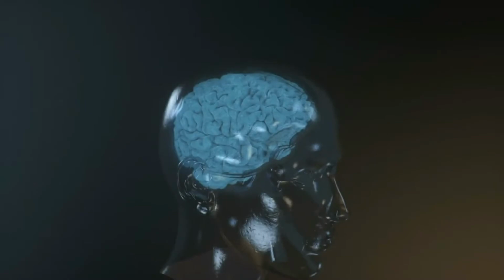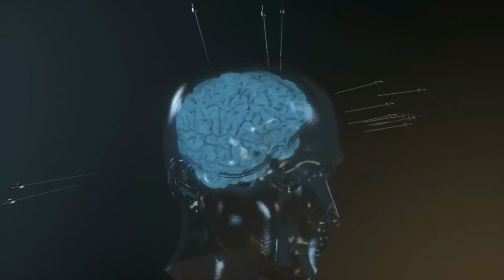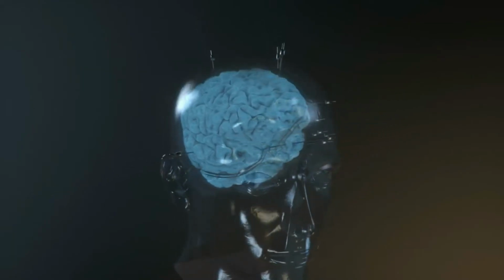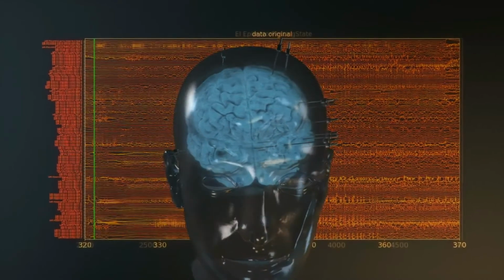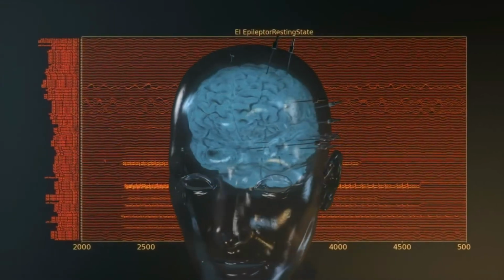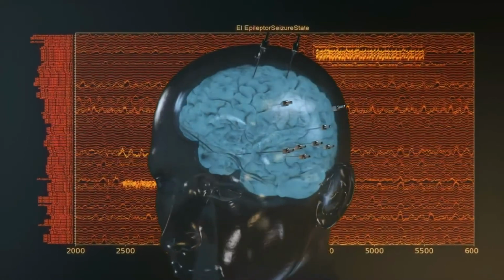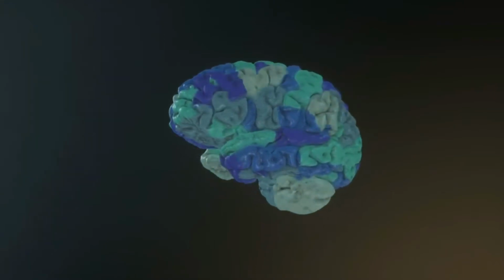The process to locate the epileptogenic zone starts with the stereotactic electroencephalography, the so-called SEEG, that records neural activity directly in the brain. Comparing the empirical brain signals to a range of simulations can narrow down the potentially affected regions of the brain. The current state-of-the-art model is the virtual brain.